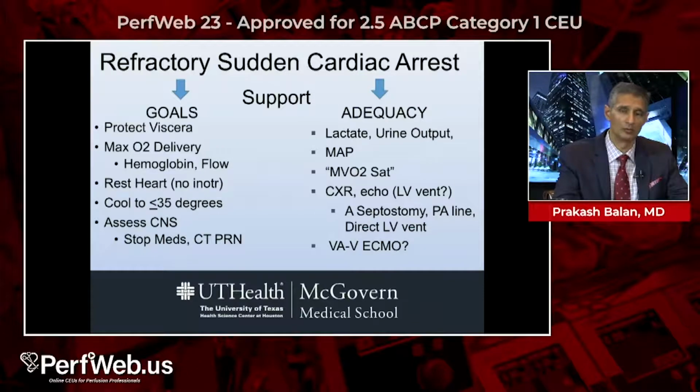Beating the heart with inotropes sometimes worsens, and there is data coming out to this effect, that actually worsens the long-term outcomes for the patients. Obviously, preserving CNS function in the setting of cardiac arrest, hypothermia is a very valuable tool here. And of course, that can be done directly through the ECMO circuit.